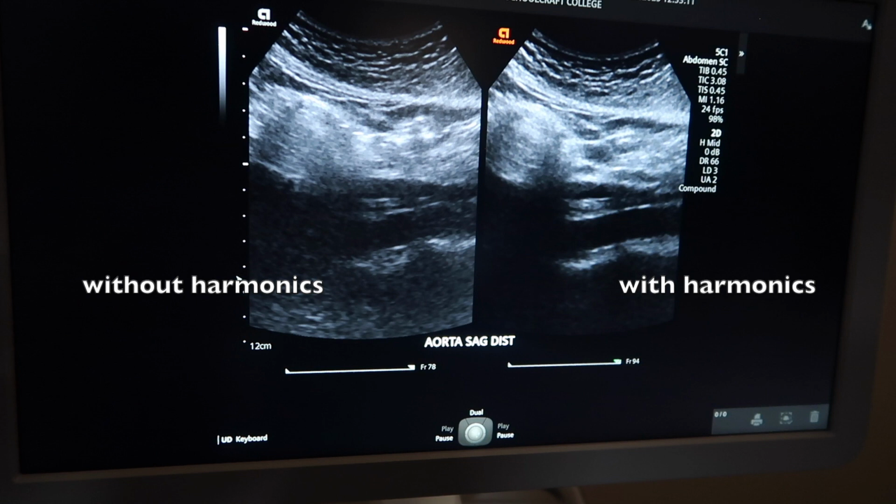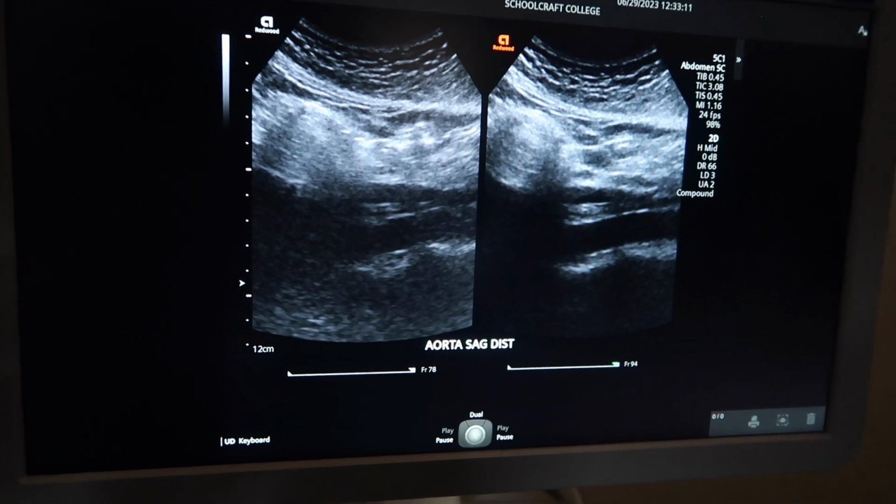This is due to the fact that the strength of tissue harmonics signal builds as the wave travels deeper into the body and then quickly dies down. It is created by the sound beam's main axis, where the beam is strongest. So it is important to try to center the structure you're trying to image. Harmonics are useful especially when you are imaging anechoic structures.